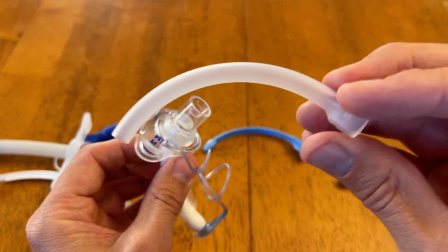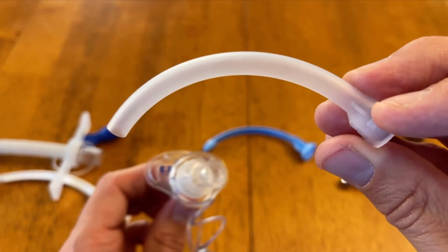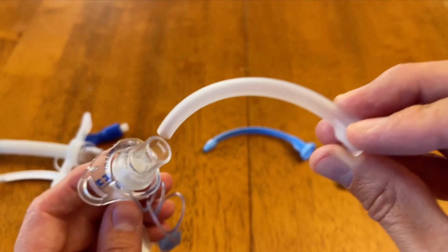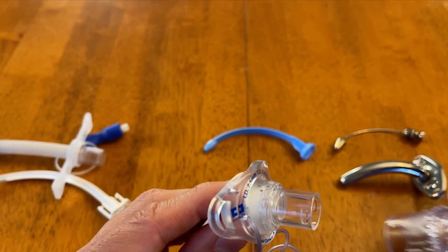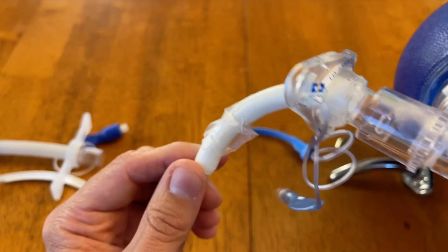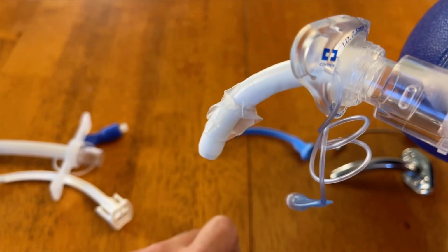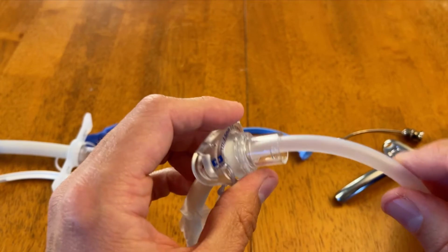Now the nice thing about these inner cannulas is it provides a way for us to clean and reuse these cannulas for the patient. And it's also nice to know in an emergency department, if this were to become obstructed, you could potentially withdraw this, either clean it and replace it, or ventilate just by hooking this up to my bag valve mask, and be able to provide positive pressure ventilation. Of course, I'd want to inflate my pilot balloon so my cuff inflates so I can direct positive pressure down to the lower airways. But this is just an example. This Shiley is a very common one that has this inner cannula in it.